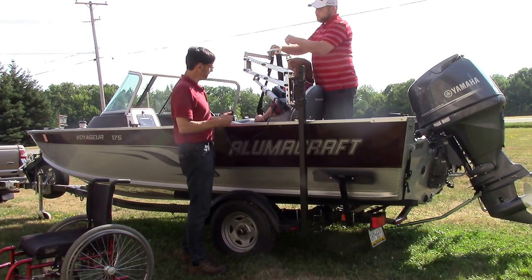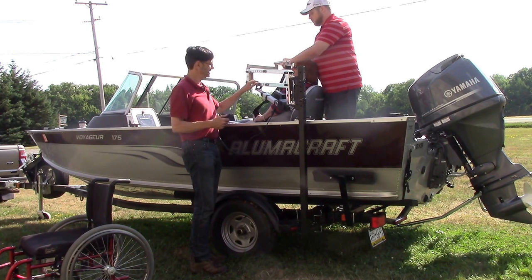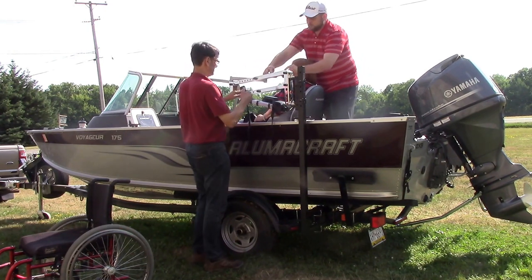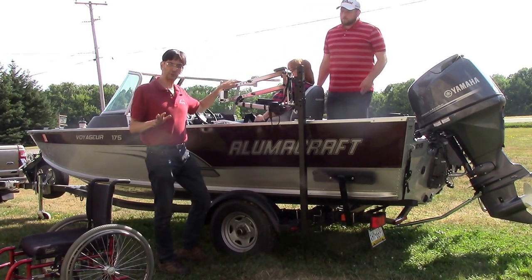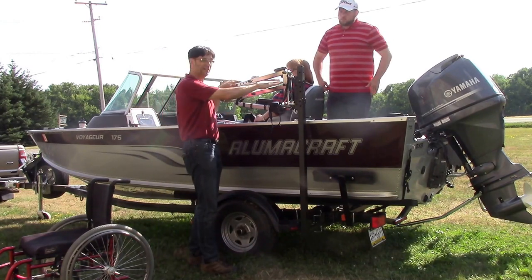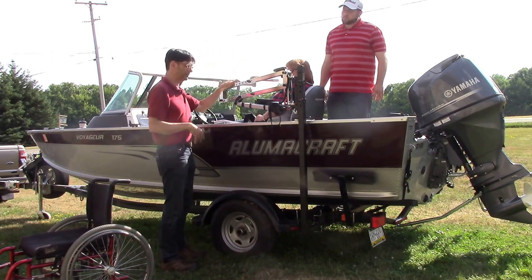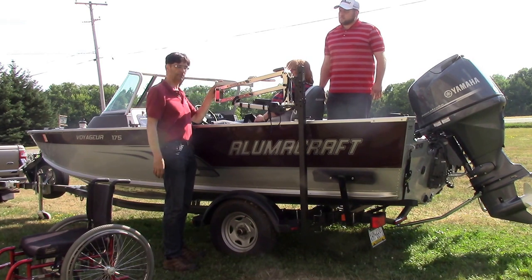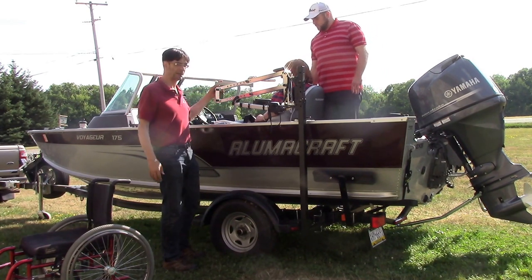Now we're going to disconnect the sling and disconnect the lift. I want to mention that if you look on our YouTube channel at youtube.com/accessun, you can also have a transom mount — mounted on the transom or on different parts of the boat. We've even seen some people use the posts, the sockets for the seats, and put a mount right in there. That's also a possibility depending on the boat.